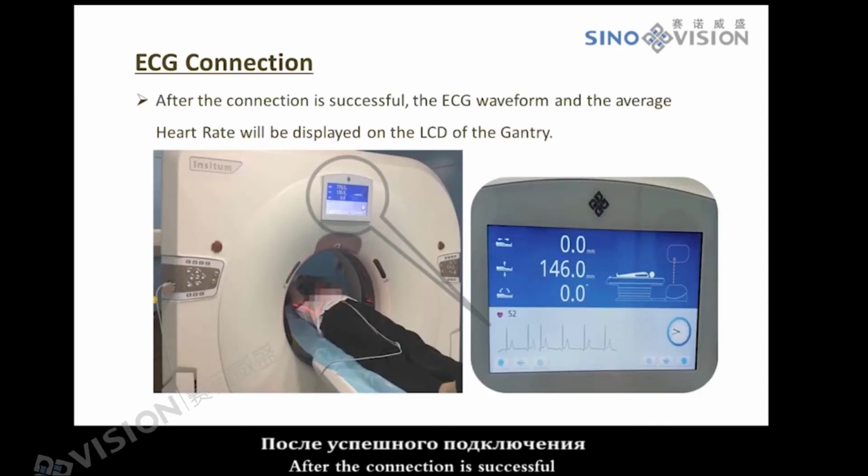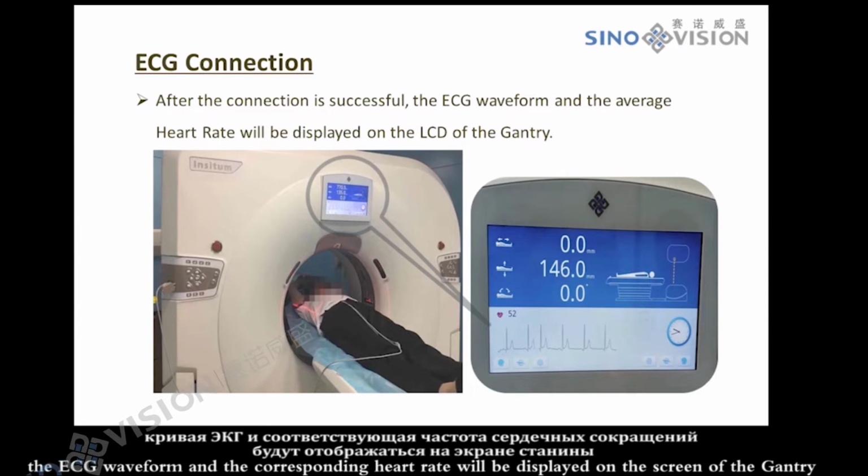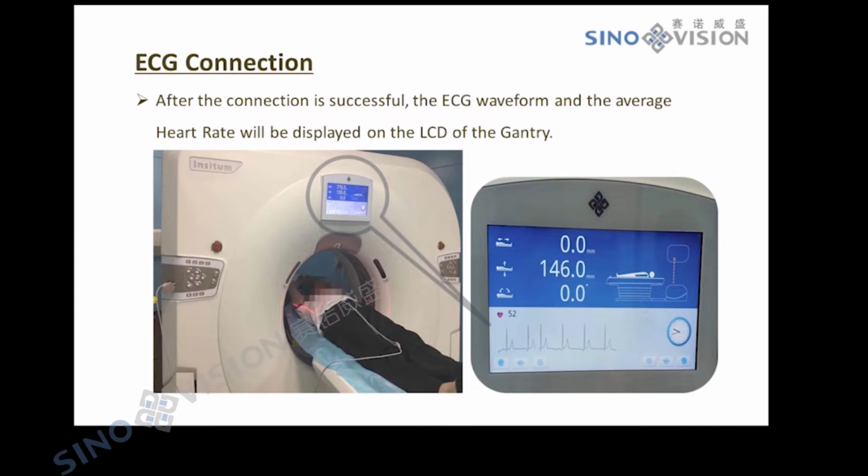After the connection is successful, the ECG waveform and the corresponding heart rate will be displayed on the screen of the gantry.